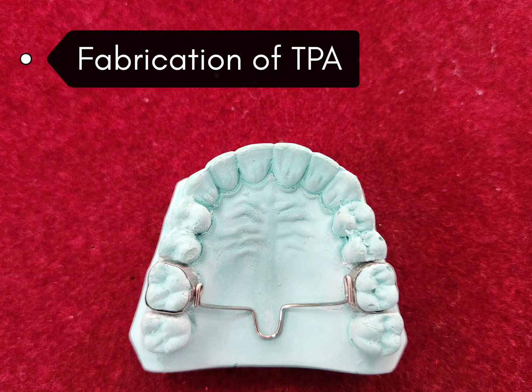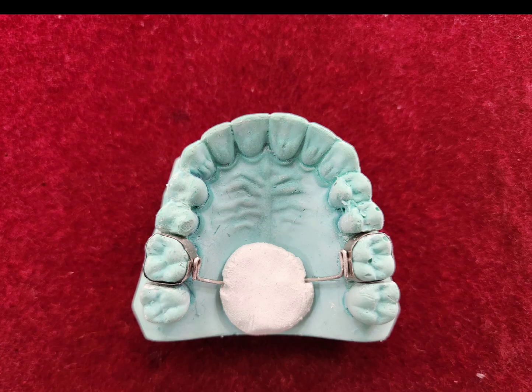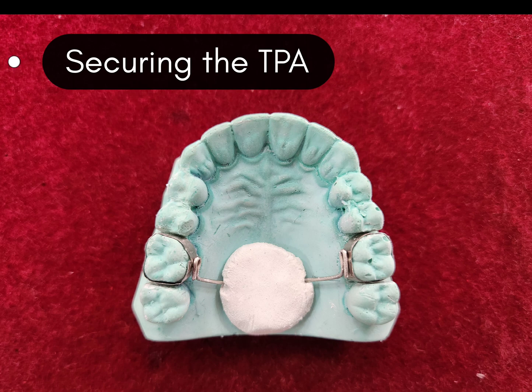Starting with the demonstration: the transpalatal arch is fabricated and is ready to be soldered to the molar band. The transpalatal arch is secured with the help of plaster.